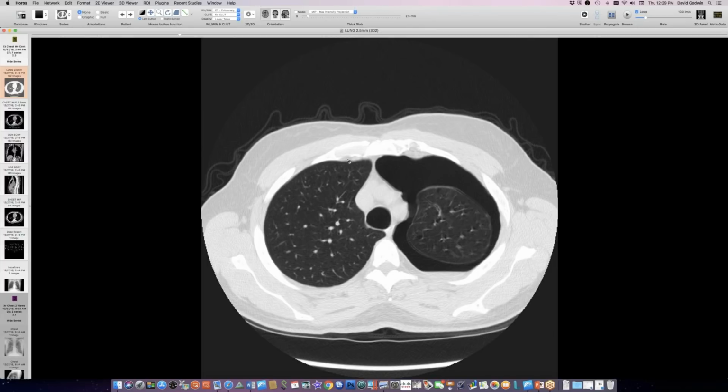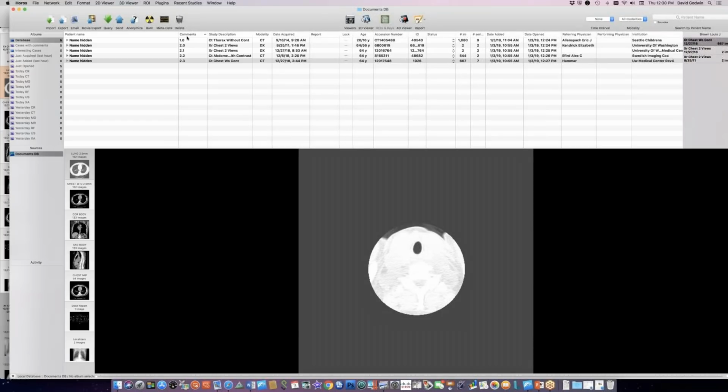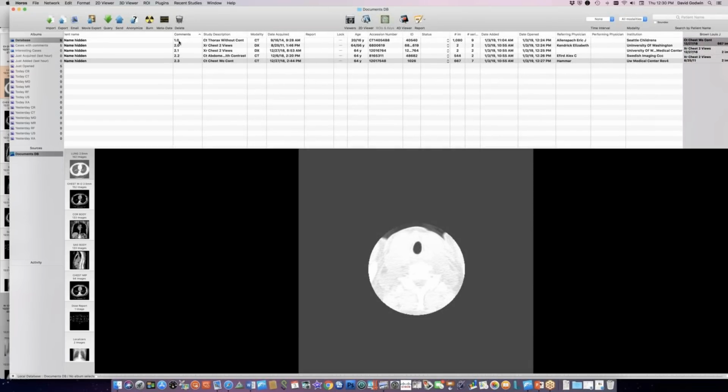Travis, let me just hang on. Maybe I can rescue this. No, I'm going to have to pull up another CT scan. So if you want to switch, and then we can switch back, I'll show you another case that I have some questions about. All right.